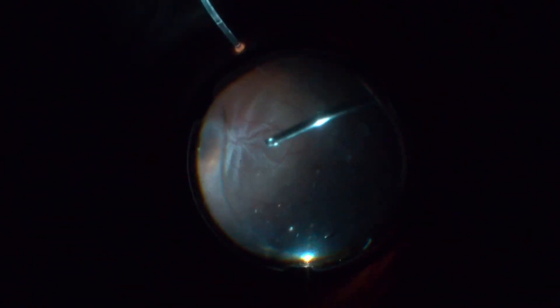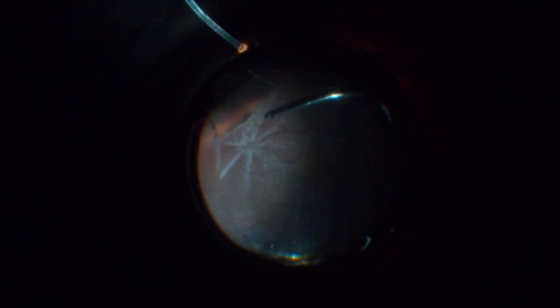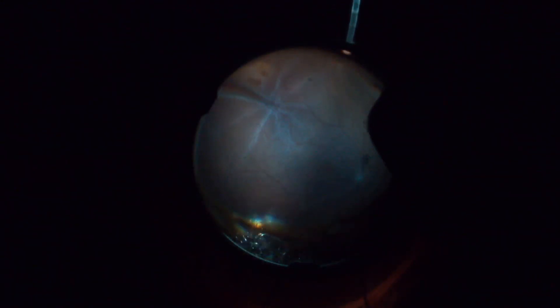The primary break is located at 4 o'clock. Membrane Blue dual stains the posterior ILM pretty well, but stains the retinal retraction fold in a poor way, as you can see.